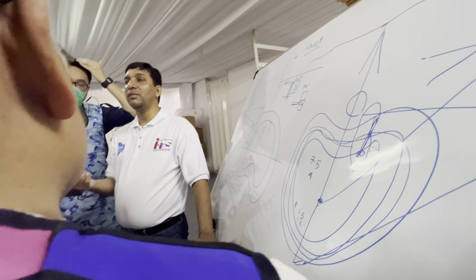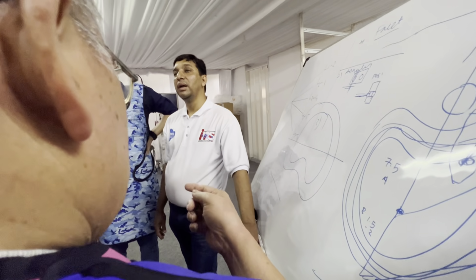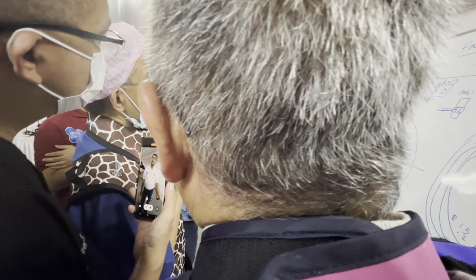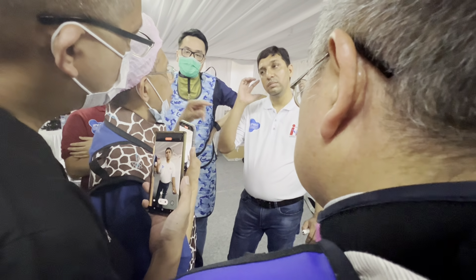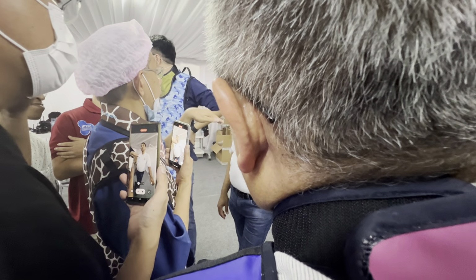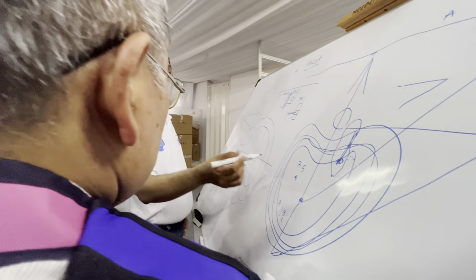Even half an hour, 1 hour, you can make the patient stand and walk. Once the sleeve is inside, it will never move and come out, because it's already stuck there. Once you have entered the space, the foramen, the sleeve will stay there. It will never come out.